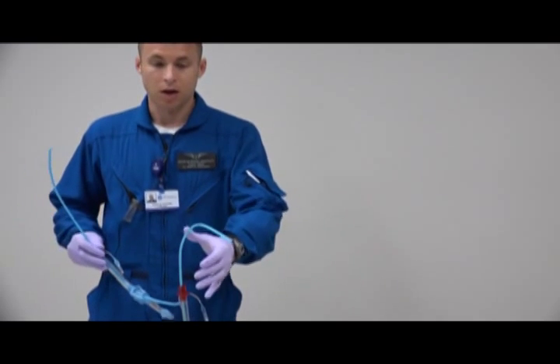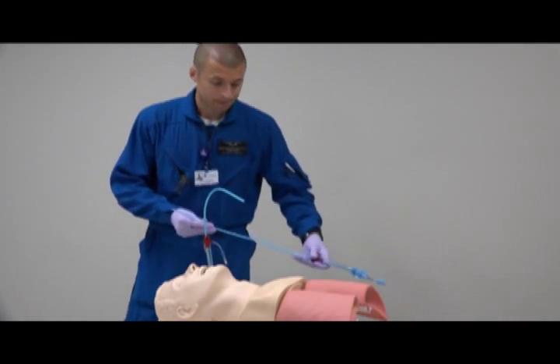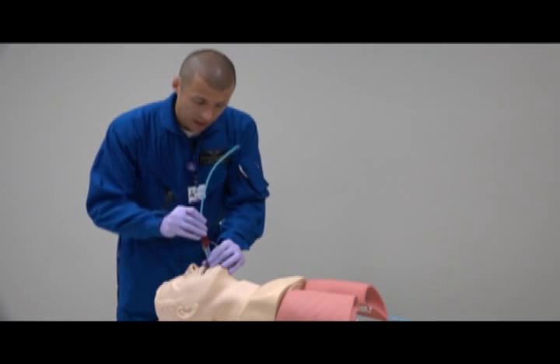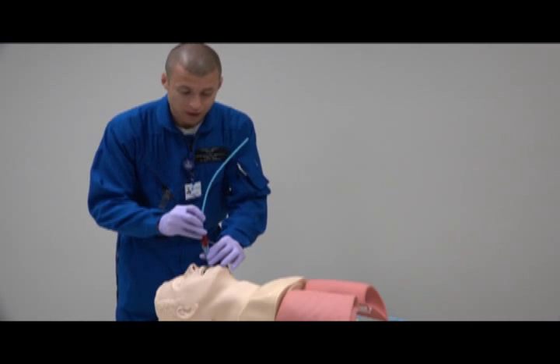I have Fred the head here already with the gum bougie and the King LTD ready to go. I made sure I lubricated it, I insert, I feel the tracheal rings — that's the nice thing about the gum bougie, you can feel those tracheal rings once you get into the trachea.